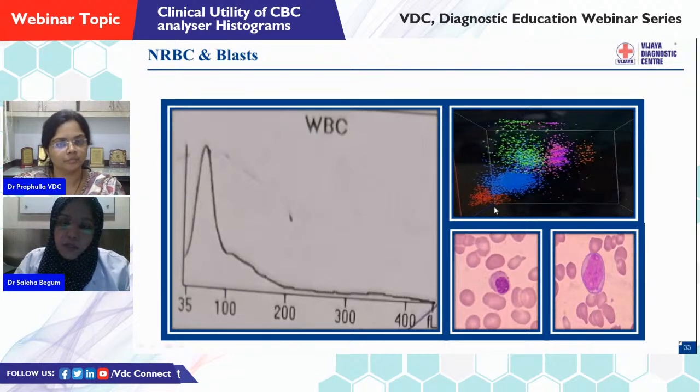So you can see in the peripheral smear also we are seeing blasts, and in the scattergram again the blue cell population is more dense compared to other populations, and below the blue cell population there are red dots which are corresponding to nucleated RBCs. Okay.